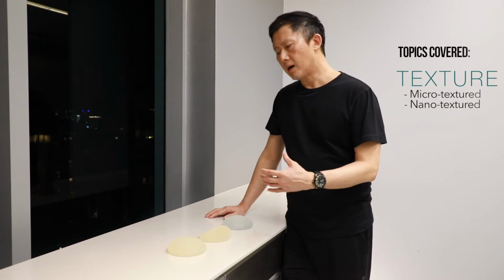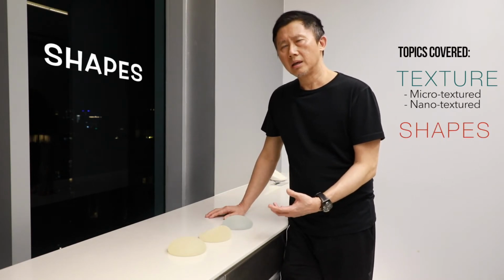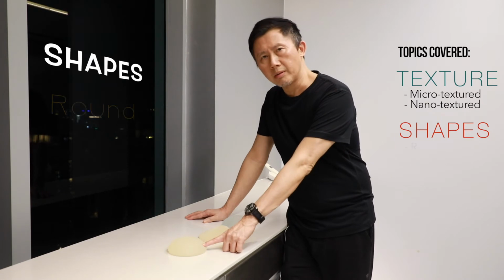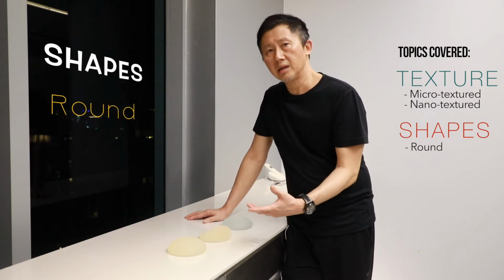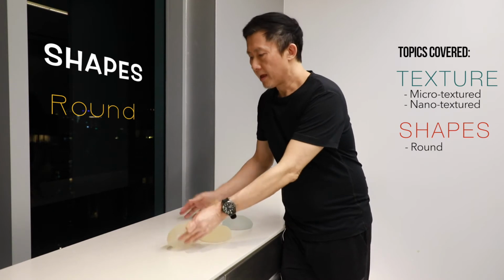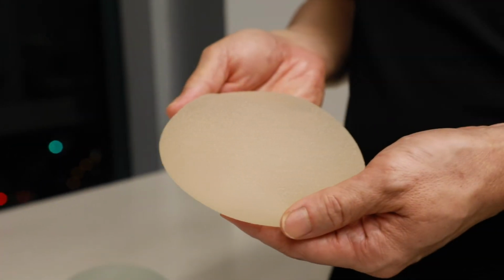Now let's talk about how these different shapes behave and how they look when they have been implanted in the body. So let's start with the round implant. The round implant was an implant that we used to use many years ago. So we talk about the old days when we used to use the round implant. Now, the round implant is shaped like a dome, as you can see.